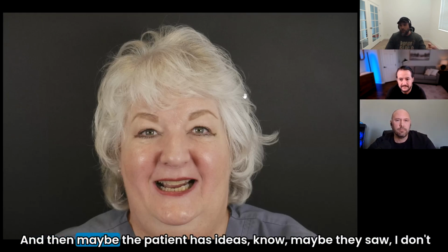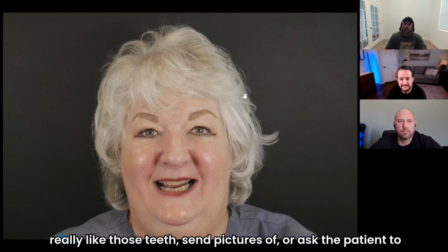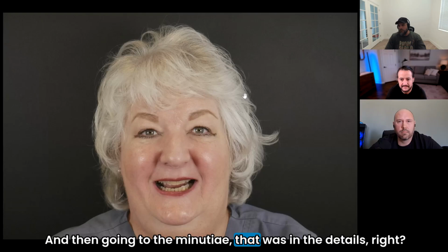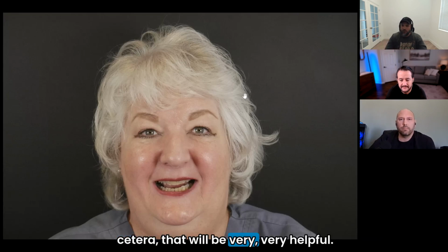And then maybe the patient has ideas, maybe they saw Jennifer Lawrence's mouth or something like that, and they really like those teeth. Send pictures of, or ask the patient to bring pictures of the teeth they've seen, so that we can try to match that as closely as possible. And then going to the minutia, that's in the details, right? So if you could tell me, I want them this long, that wide, et cetera, that will be very, very helpful.